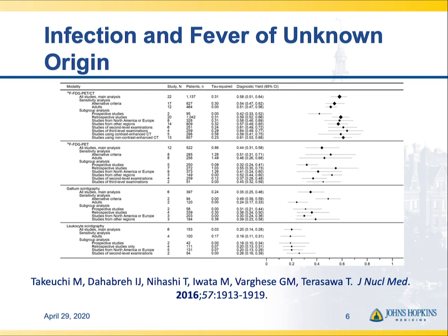So I think for whole body imaging for fever of unknown origin in a patient that doesn't have a confirmed infection, FDG-PET's actually a great way to go. It won't necessarily be easy to have, say, insurance pay for that indication, but there is literature supporting it, and it can be the right thing to do for patients.